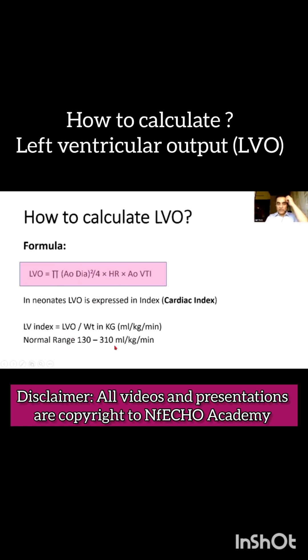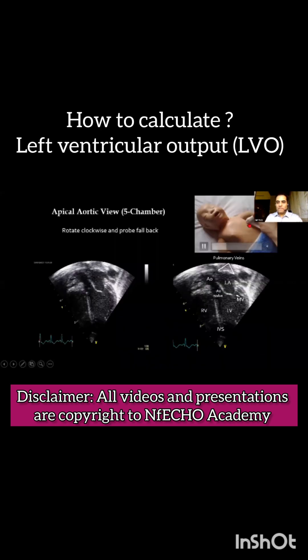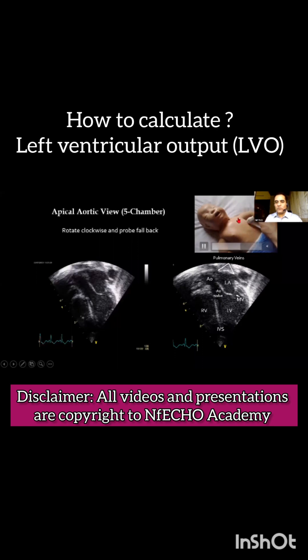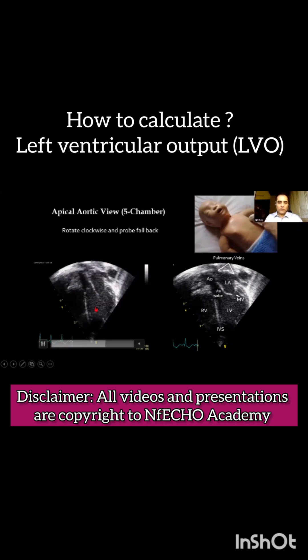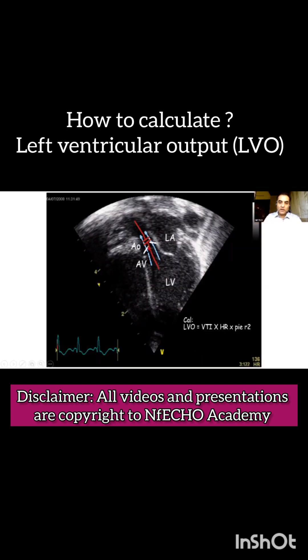The normal value is 130 to 310 mL per kg per minute. To calculate the aortic VTI, we keep the probe in the apical window with the pointer pointing at 3 o'clock and sweep upwards. The fifth chamber, that is the aorta or left ventricle outflow tract, comes up. We then keep the pulse wave Doppler gate in the aorta just above the aortic valve, as seen in this picture, to calculate the aortic VTI by tracing the pulse wave Doppler in the aorta.